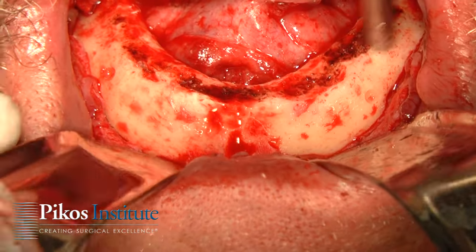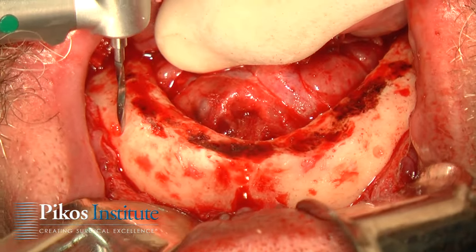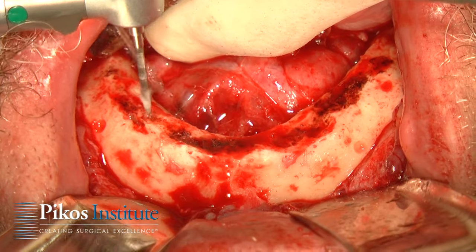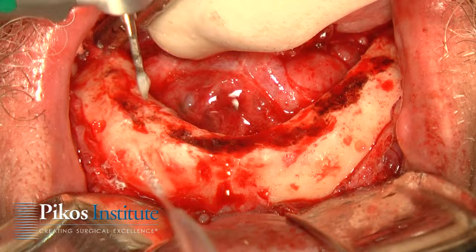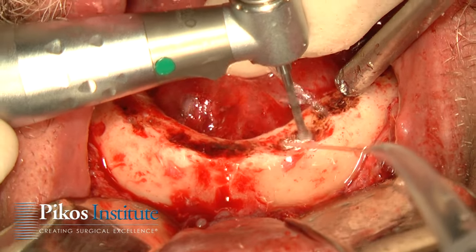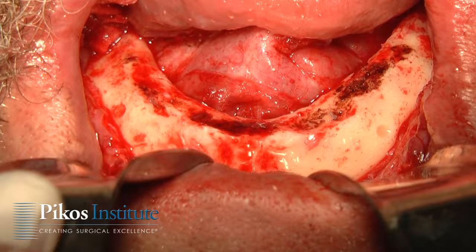Now we'll begin the osteotomy for the implants themselves. We're planning on three 8mm implants. There's the anterior extent of our foramen — we're going to be about 4 or 5mm anterior to that. This is just a starter drill from Salvin. Just make sure that we're missing the anterior loop. We'll do the same thing on the left side, about 4 or 5mm anterior, and that protects any potential anterior loop, which I don't even look for anymore, although we do evaluate the mandible.